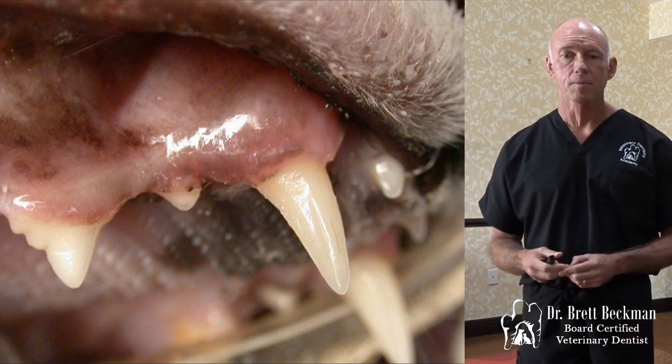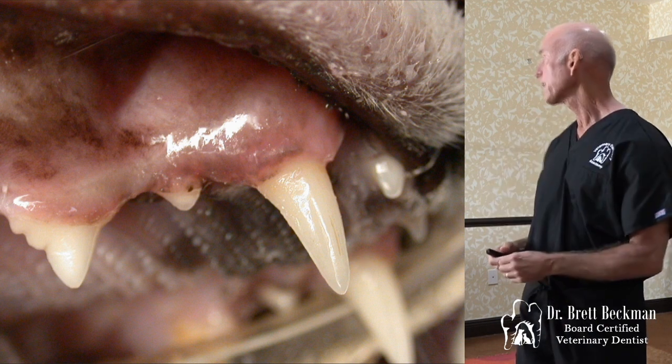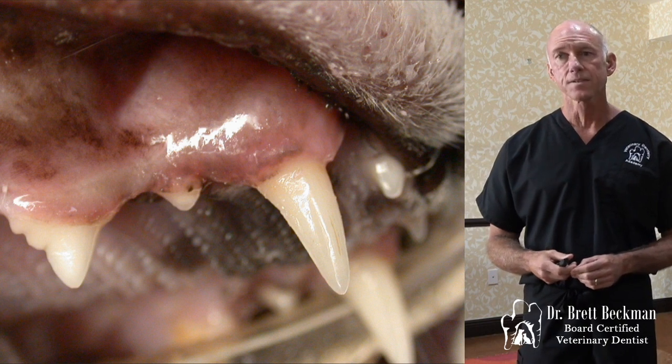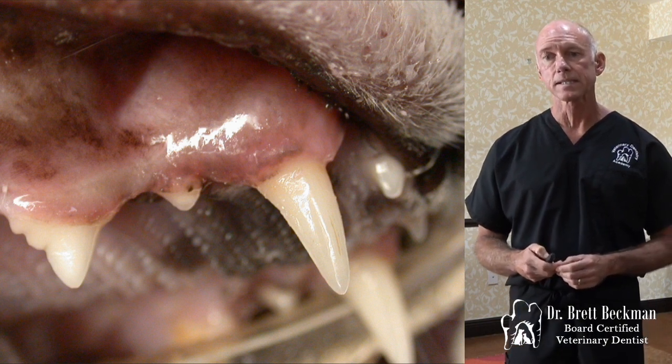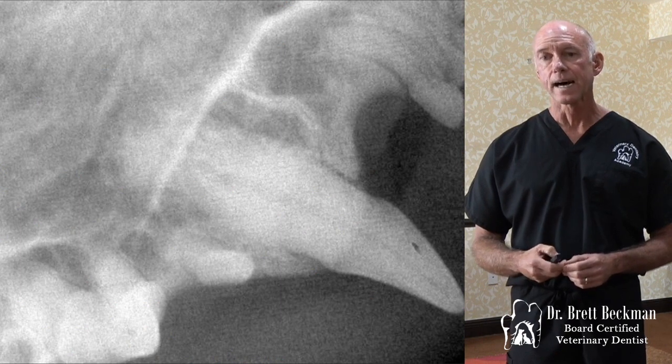So here's a couple images on the same patient. So that looks pretty good. I don't see personally any changes there that I would jump on grossly. Radiographically, what do you got?